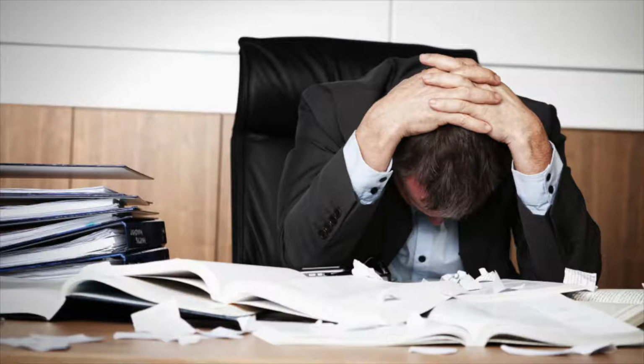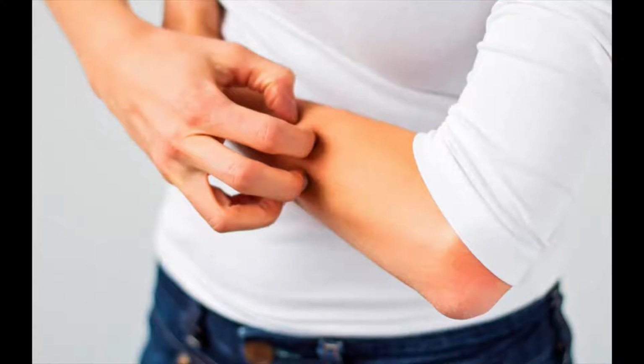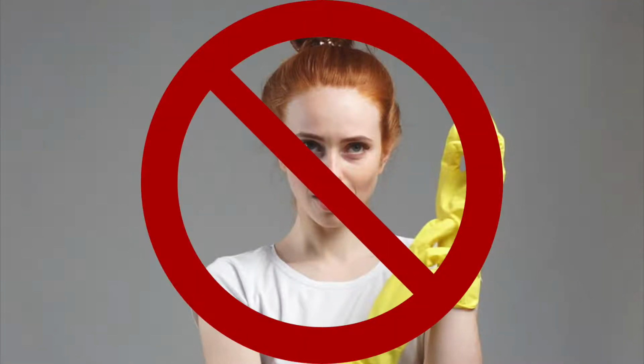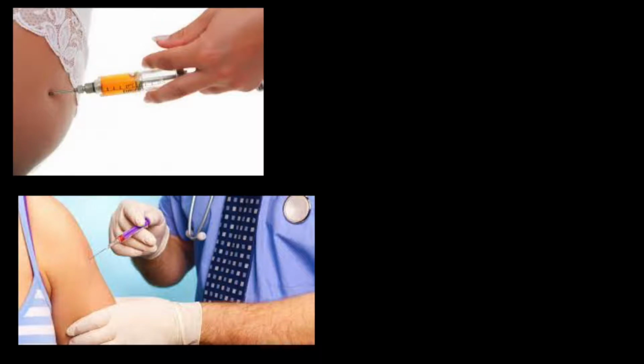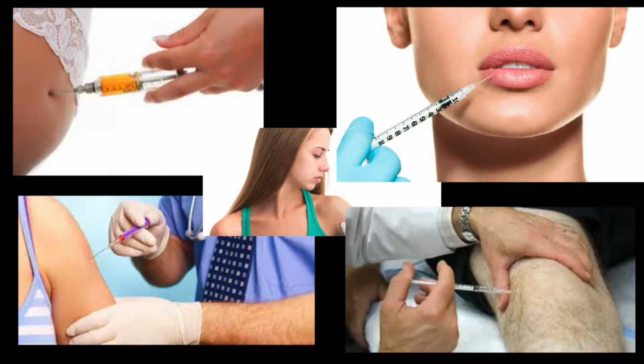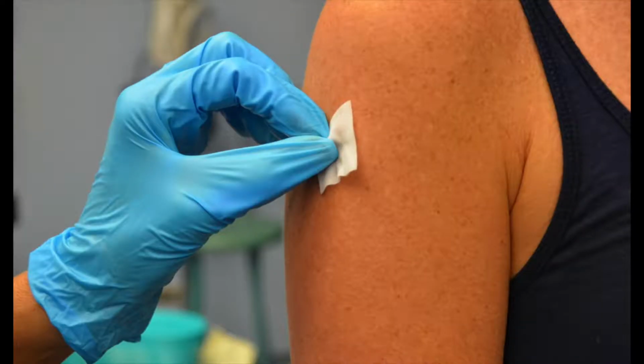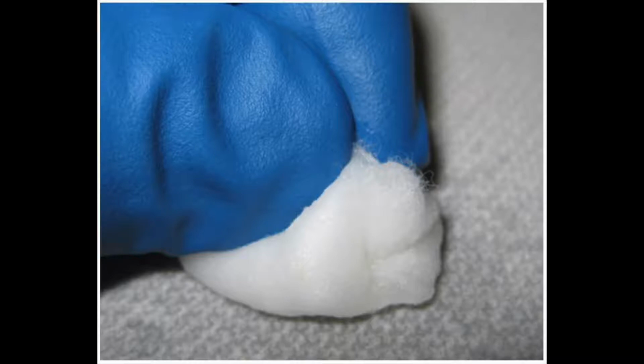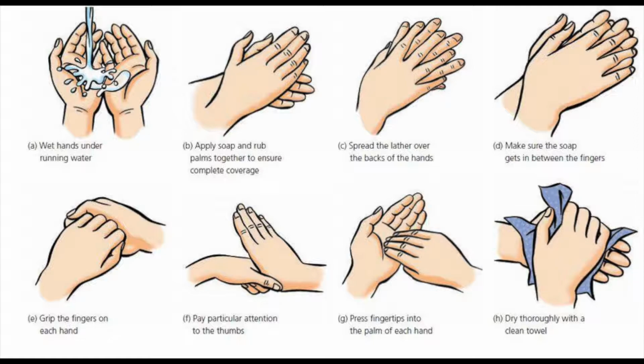Have you ever had this medication before? Were there any difficulties with this medication in the past? No? Good. Then if you're ready to proceed, I'll ask you to roll up your sleeve on the left side while I wash my hands and get some gloves. This injection will not be unlike other injections you've probably had in the past. I'll clean the area with some alcohol, insert the needle, inject the medicine, withdraw the needle, and briefly apply some pressure with a cotton ball. Any questions?"